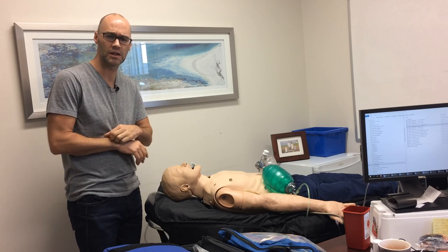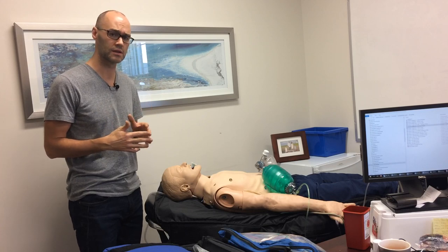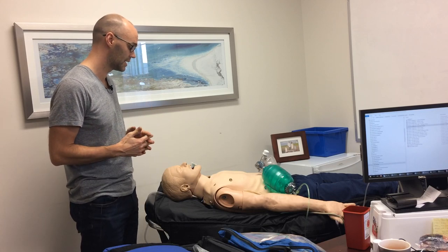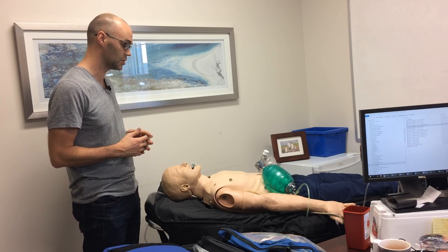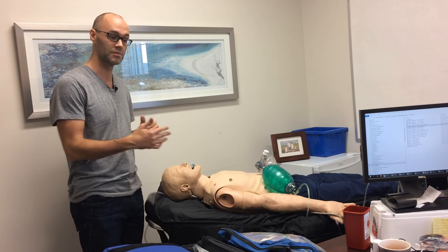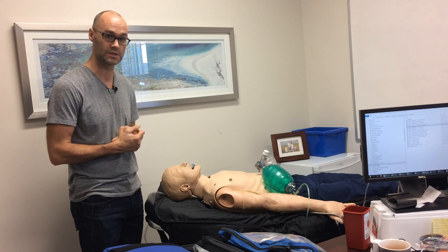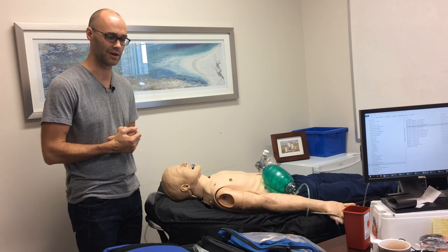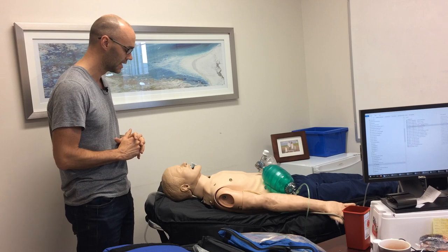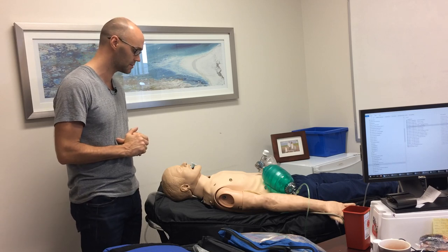Or what is the predicted clinical course? Predicted clinical course is a really good thing to think about — whether or not the patient needs to be intubated now, or if that can wait until they get to the emergency department if they require other treatments, for example a trauma patient. So once you've identified that you have a patient you want to intubate, you're going to assess.